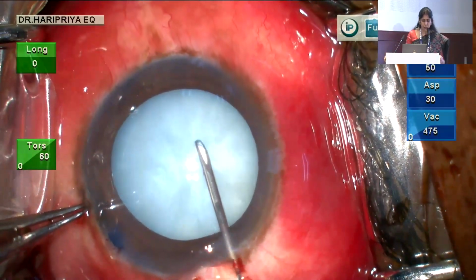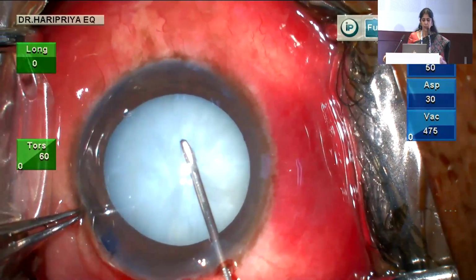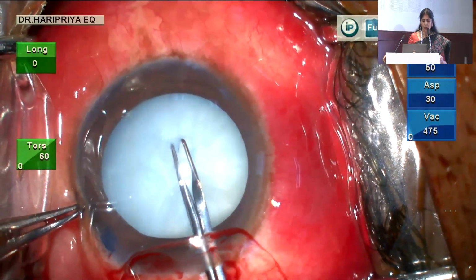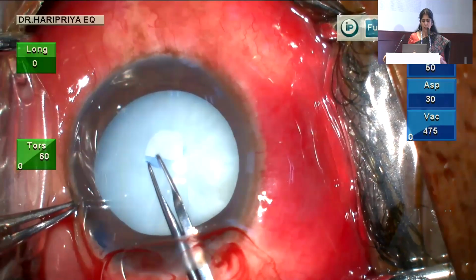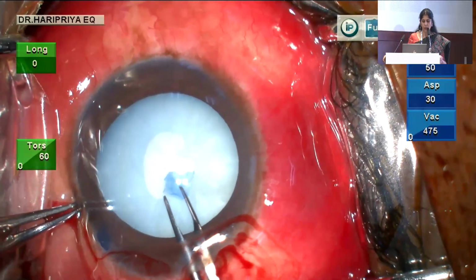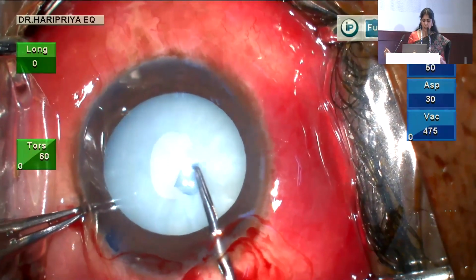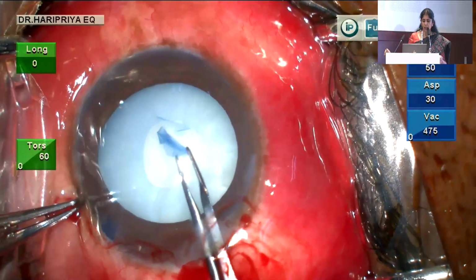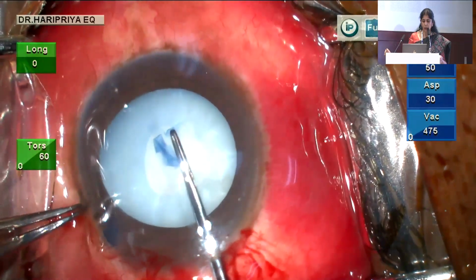In another situation, one may also consider doing a small rhexis but enlarging it towards the end, what we call a spiraling technique. So in all these intumescent lenses, one uses a rhexis forceps. So please invest in a good Utrata. So this one is from Epsilon and is a Haldipurkar forceps, and this works very well through a 2.2 as well.